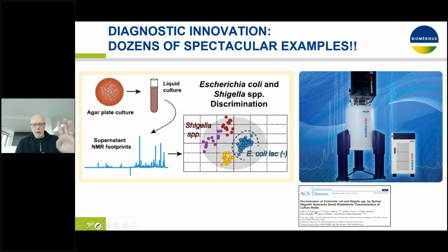And some technologies are better at certain aspects of this clinical diagnostics than mass spectrometry is. And we published something on NMR as a tool, which is not a very good example of a technology that's going to replace mass spectrometry in the lab anytime soon. But it's just to illustrate that in some cases, it's also good not to look at the organisms themselves, but at the metabolites that they produce during growth, because that may be a little bit more sensitive than looking at cell numbers. And it may also lead to signals that are generated earlier in the growth cycle of organisms.